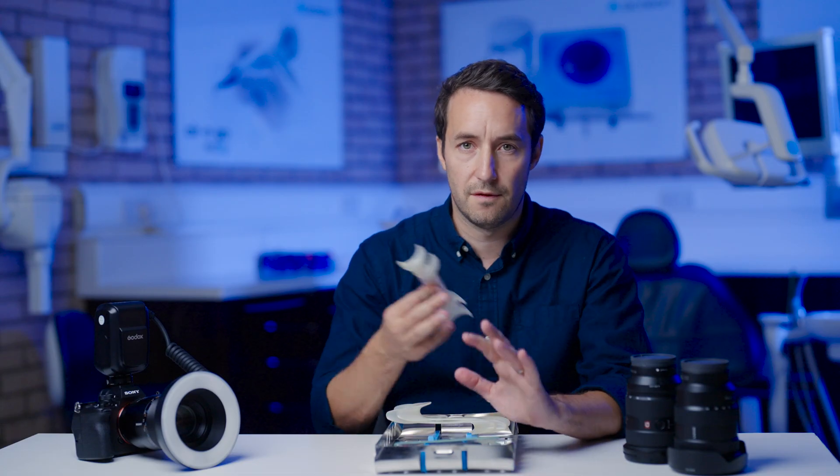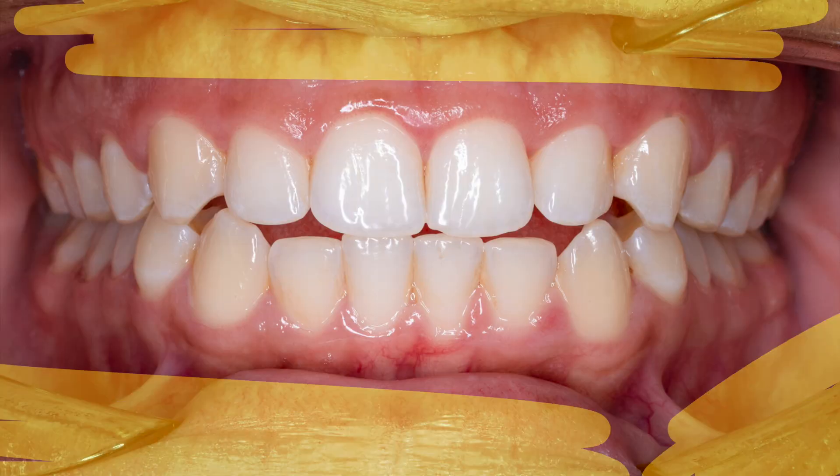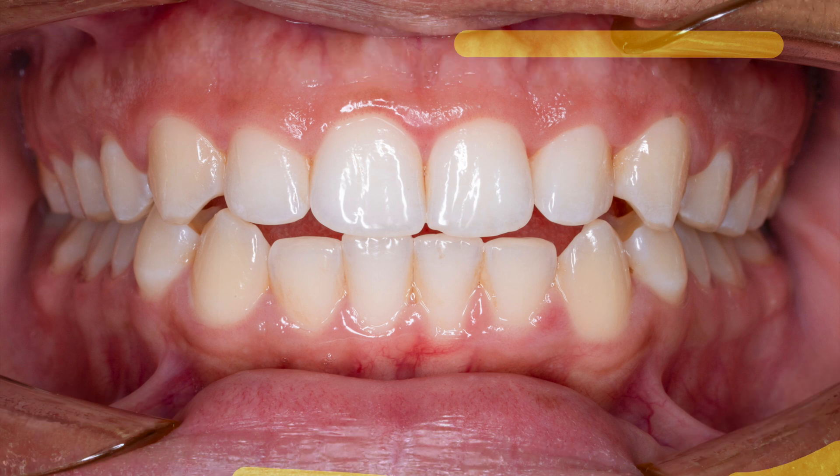Having two sizes of each accommodates for the varying range of mouth sizes and retraction abilities. The main aim of retraction is to remove the soft tissue away from the area of interest, so the choice of retractor is ultimately dependent on what retraction you are aiming for and what you're photographing.